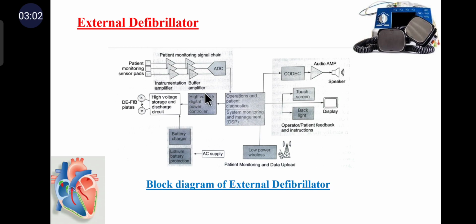The basic defibrillator contains the usual components such as a high voltage power supply, storage capacitor, inductor and patient electrodes, and it develops an electrical charge in the capacitor to a desired voltage, creating the potential for current flow. The higher the voltage, the more current can potentially flow, and this defibrillator outputs audio instructions and visual prompts to guide the operator through the defibrillation procedure.